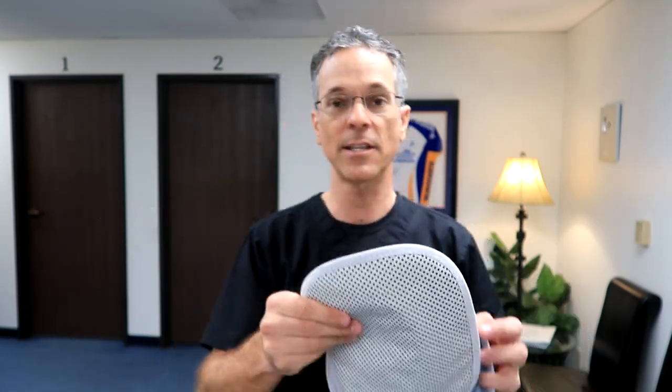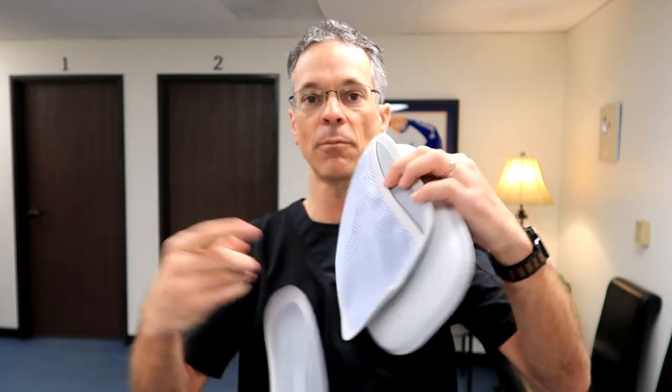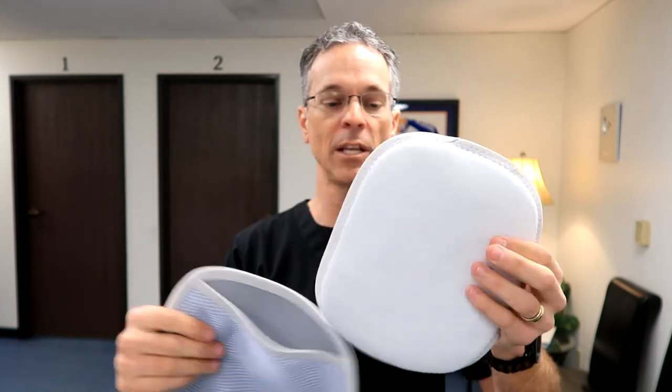It also has these other pads that can attach to the inside of the back brace, and these can be warmed up. There's a little pouch where you can put a heating pad or an ice pack — I usually use heating pads. These are very, very nice.